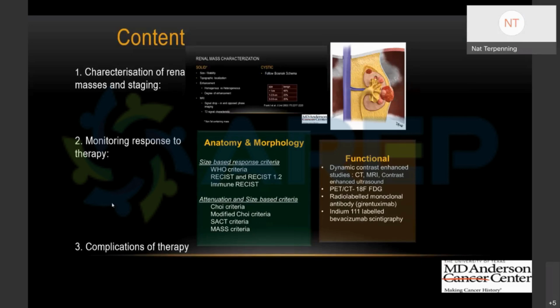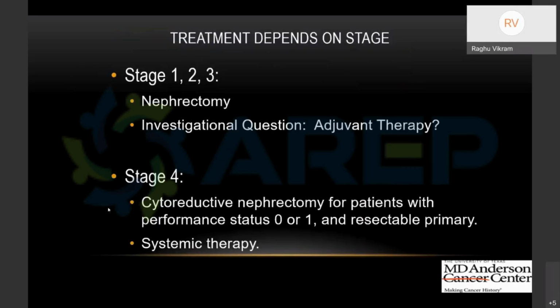Okay. So we'll go to the next part, which is monitoring response to therapy, which I think is very important and very unique in renal cell carcinoma. The reason is we use a lot of different types of chemotherapy.